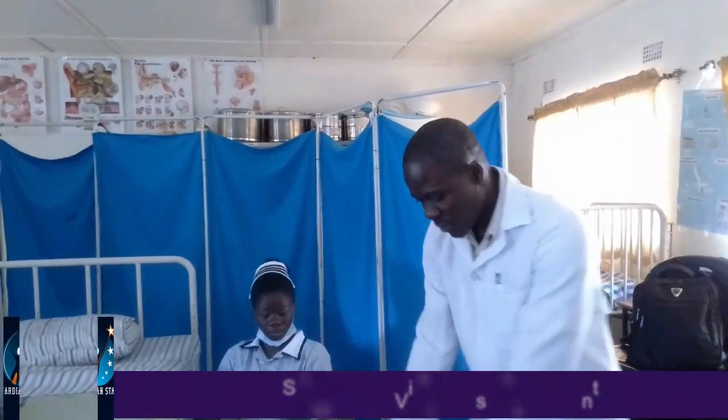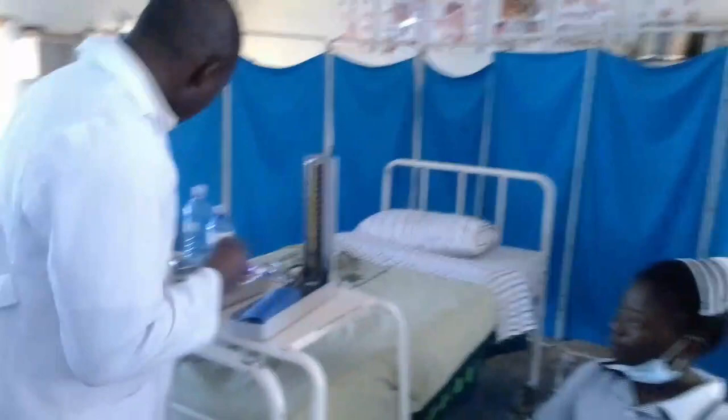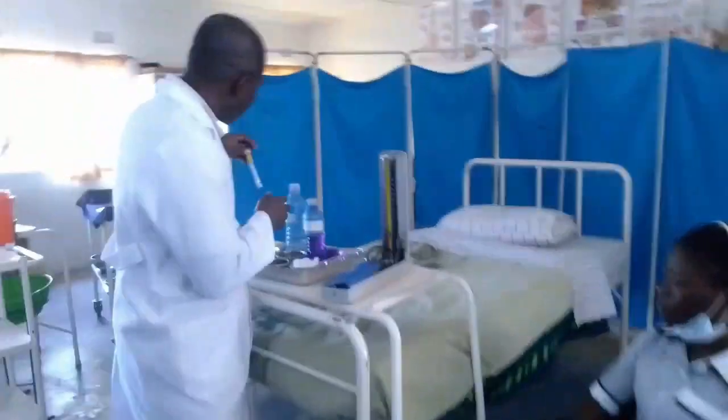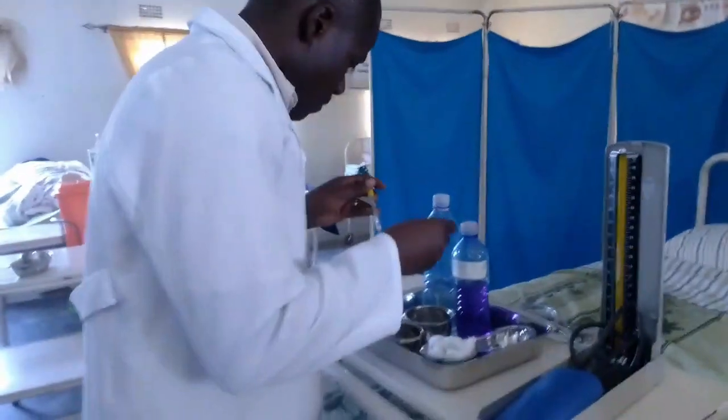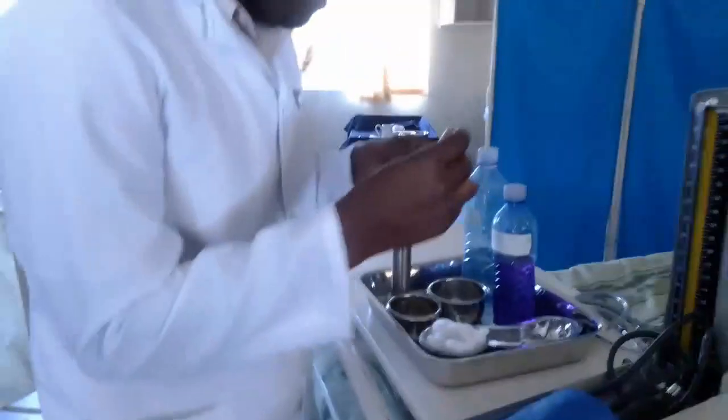So the first thing that you do, Ms. Kasapo can move closer. Ms. Kasapo has moved closer. So I'll have to get the thermometer. I have to choose. This is the thermometer I will use.